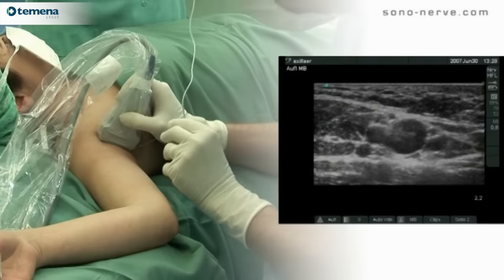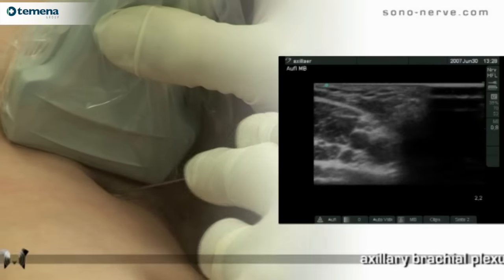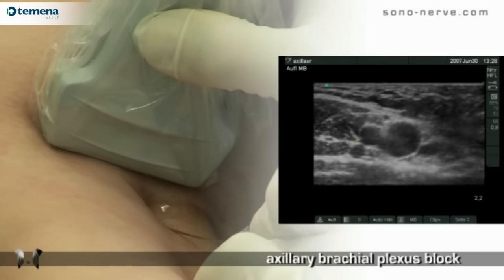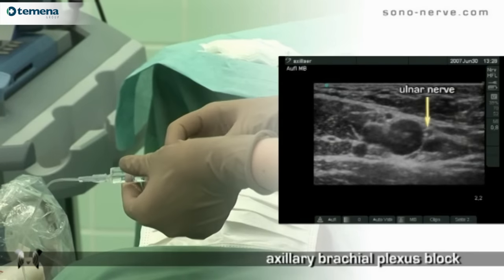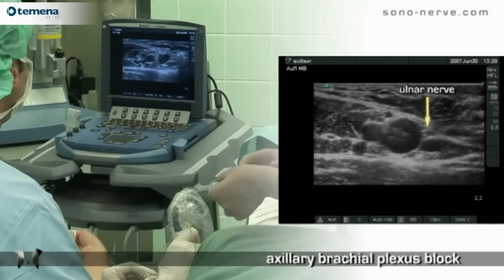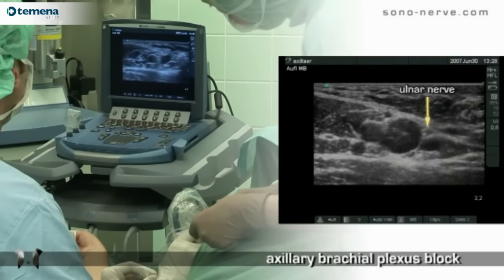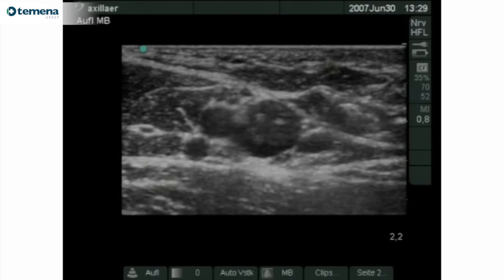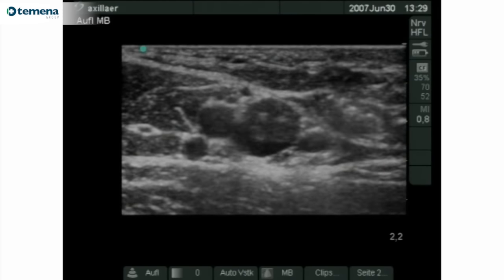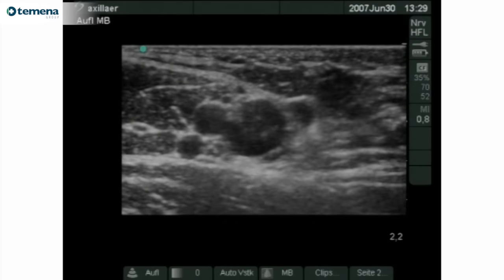This is an out-of-plane technique with the needle introduced approximately at right angles to the skin of the upper arm. First, the needle is passed towards the ulnar nerve, lying at the three o'clock position. Once the needle lies close to the ulnar nerve, local anaesthetic is injected and is seen to surround the nerve.